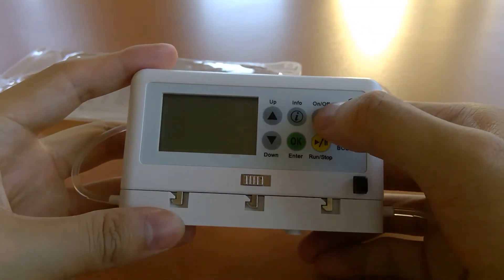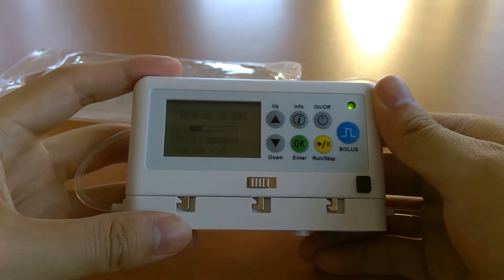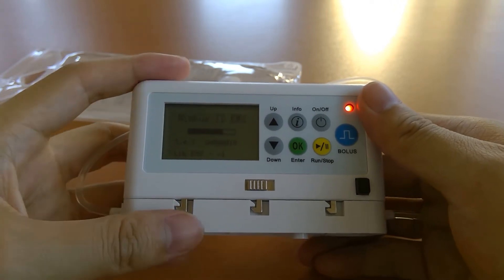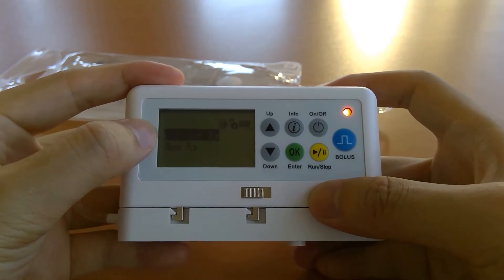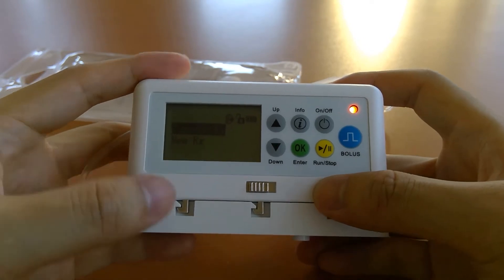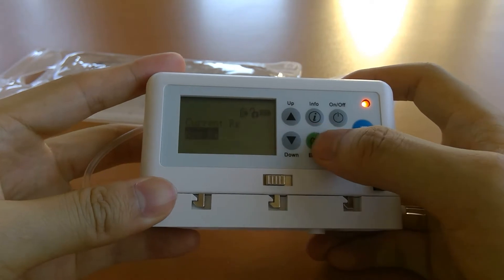To turn on the pump, hold the on/off button for three seconds until you hear a beep. The screen turns on and shows library information, firmware, and other technical details. You'll then see the main screen. If the pump has been run before, you have the ability to resume or rerun an infusion under current Rx, or you can go down to new Rx for a new prescription and press OK.